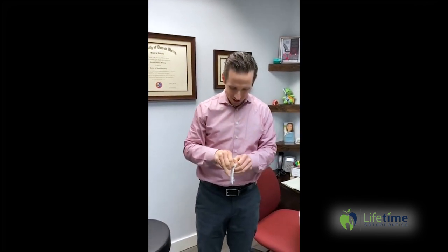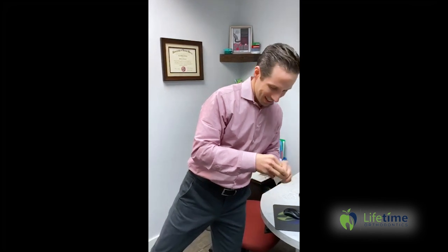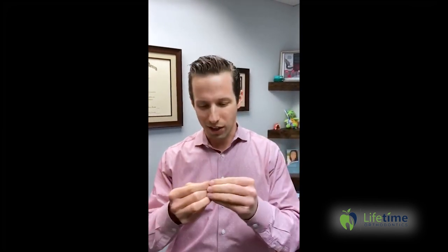I'm going to show you my technique — one I developed myself — and I'm going to officially coin the name. I call it the Dink and Flick technique. For all you Office fans out there, that's from the episode where Daryl teaches Michael Scott some slang. Every time I use this technique to put my elastics on, I think about that.